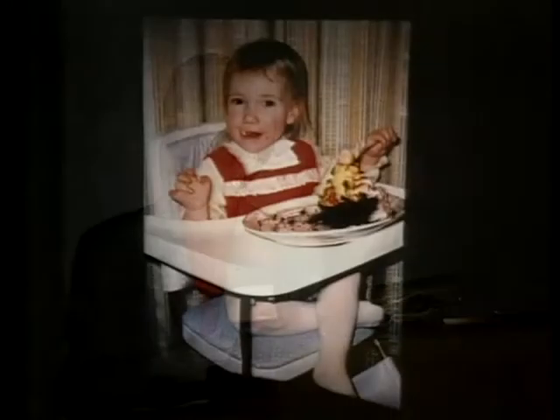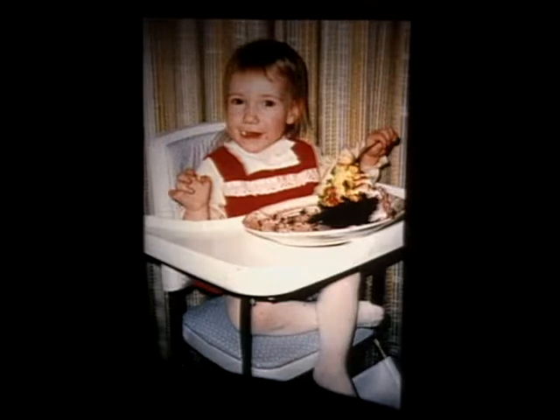Then you want to begin to implement wearing the Passy-Muir valve during feeding times as appropriate. Kind of a staged approach. First you try it during your easy times, then you try it during your little more stressful times. And this young girl is eating her birthday cake as she's wearing her Passy-Muir valve. She has quite a big plate of birthday cake too.